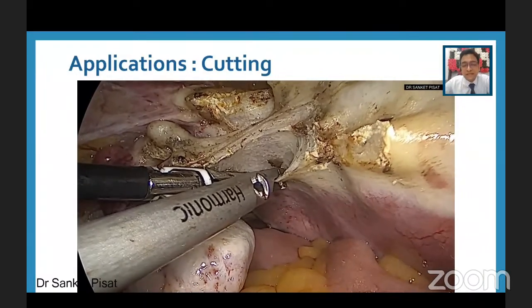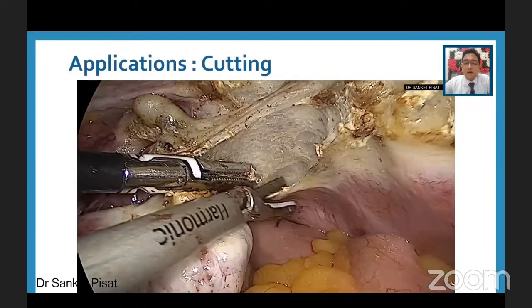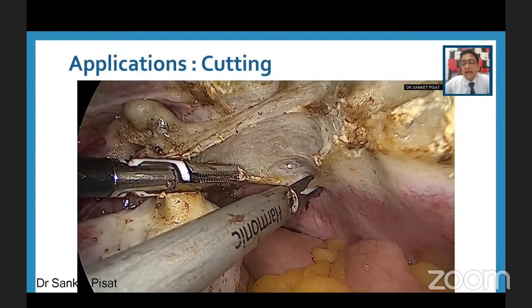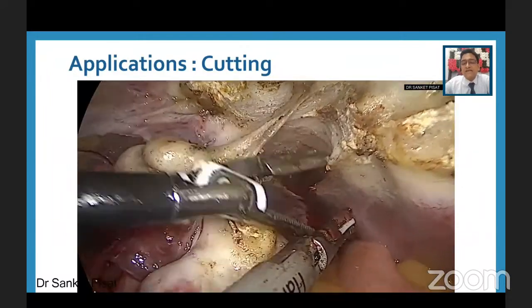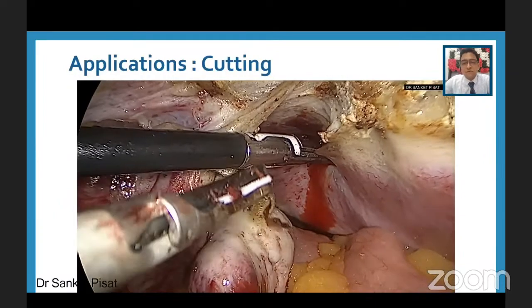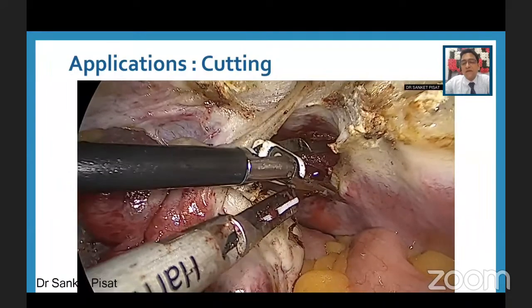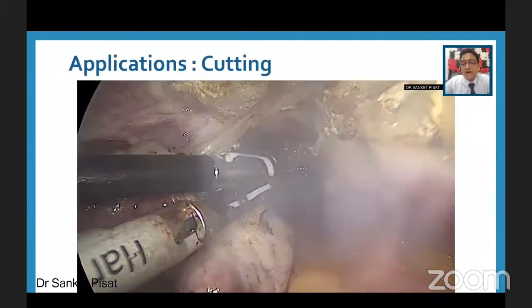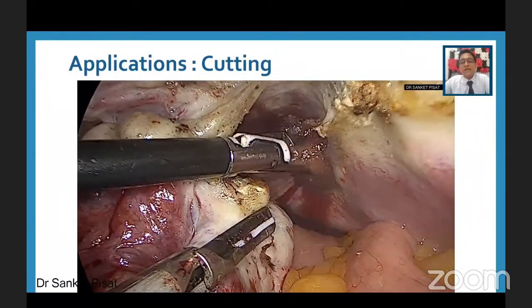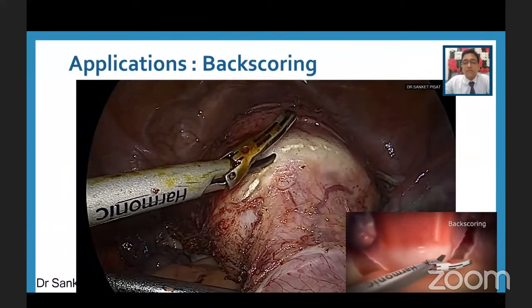For example, in this case, I am doing the same thing on another patient, but not mindfully, I decided to use the active blade inside, and unknowingly, after using the active blade, you can see that it touched the uterine vein, and then of course the rest of the story is well known. It becomes very messy, one has to coagulate again and again, the bleeding doesn't stop, and you don't really want to use it in this way. So remember to keep the active blade away from any vital structure to avoid any problems.